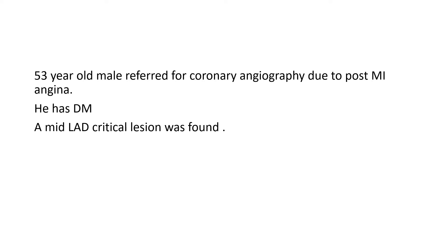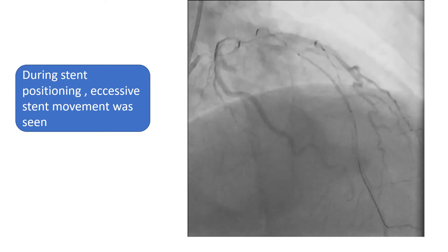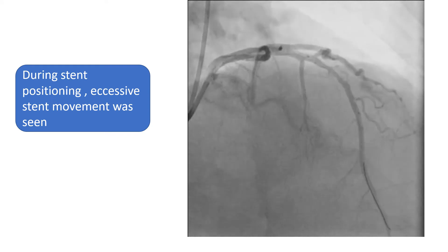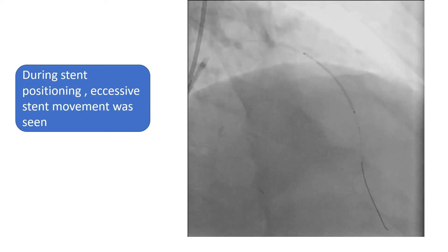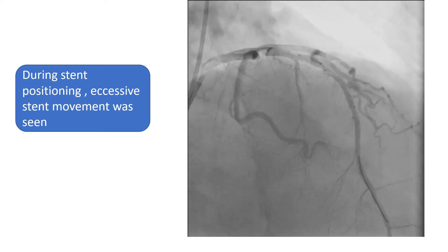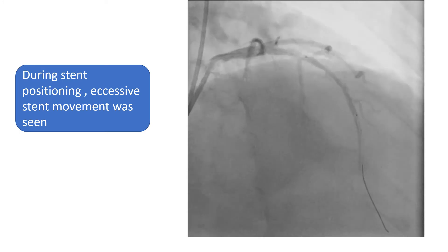The first case is a 53-year-old male referred for coronary angio due to post-MI angina. He is diabetic, not hypertensive and non-smoker. During angiography, a middle LAD critical lesion was found. This is a cranial view of the left coronary system. It shows a long stent to be deployed in the middle LAD. We can see the stent is moving about 8 to 10 mm with each cardiac contraction. This movement would prevent accurate placement of the stent.